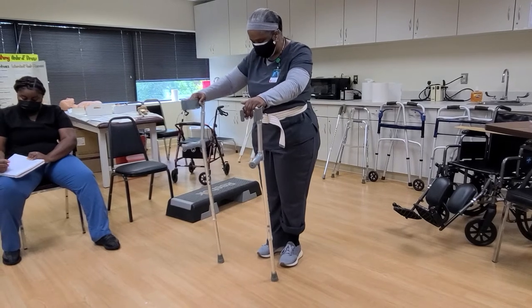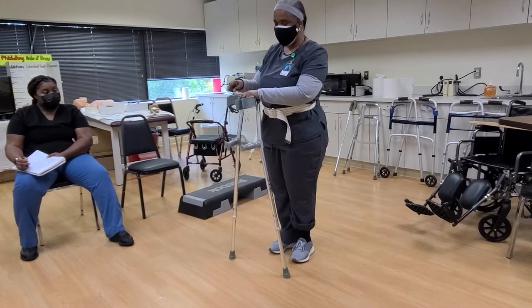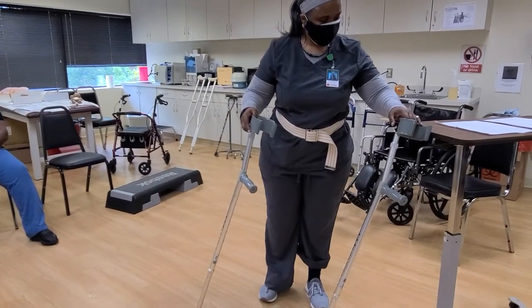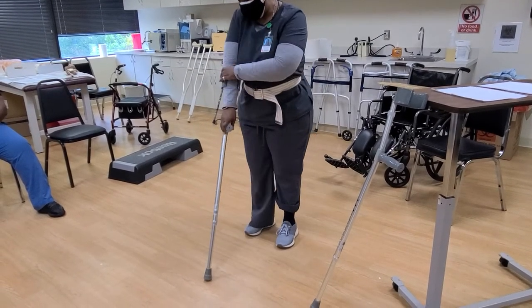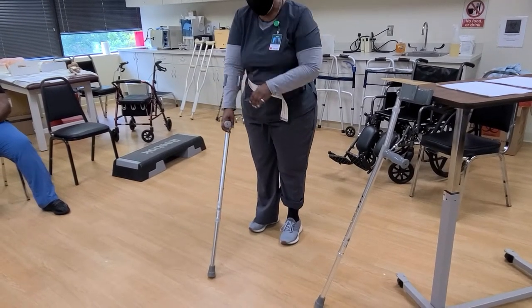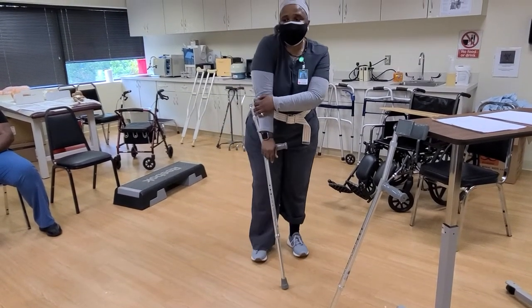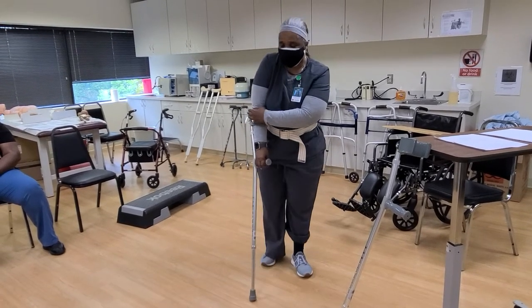One of the things you want to do first is adjust the forearm cuff — the part that goes around your forearm. You want to make sure it's not at the bend of your arm.